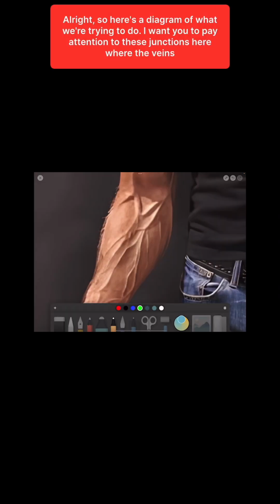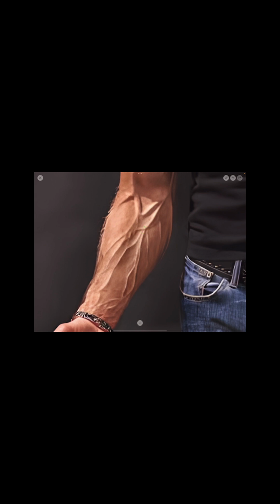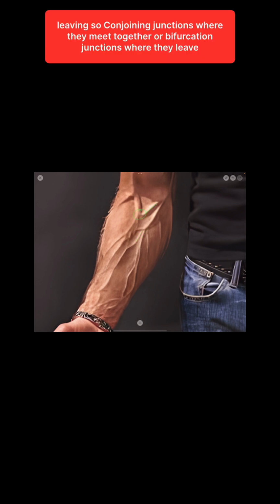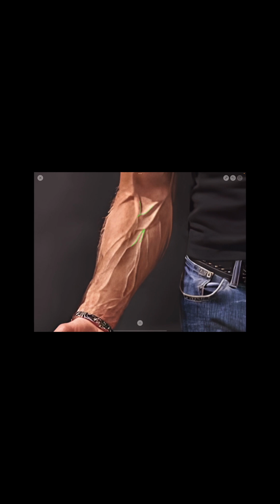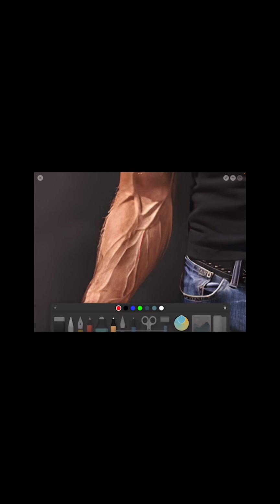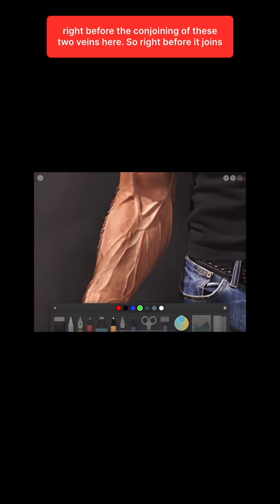Right, so here's a diagram of what we're trying to do. I want you to pay attention to these junctions here, where the veins are meeting together or they're leaving. So conjoining junctions where they meet together, or bifurcation junctions where they leave and separate into different vessels. I was hoping to get it to terminate right before the conjoining of these two veins here.